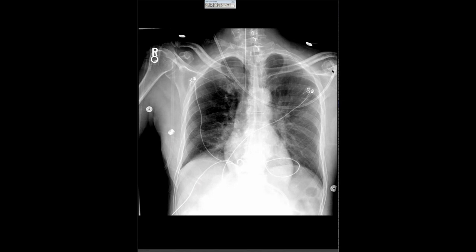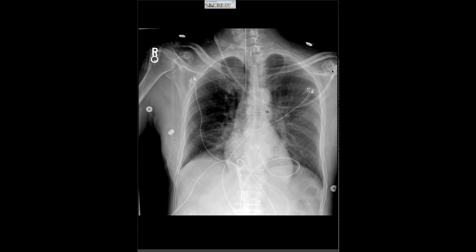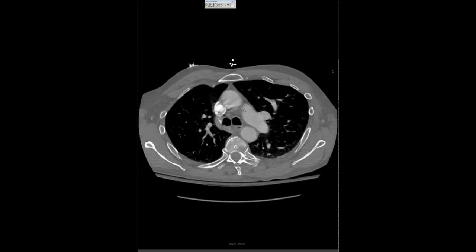All right, so this is a radiograph of someone in the ICU, and you can see there's clear asymmetry between the left lung, which is more radiodense than the right lung. Very ground glassy. So differential considerations for this would be layering pleural effusion, asymmetric soft tissue. We noticed that they're intubated in the ICU, so probably not able to follow breath hold instructions for the radiograph. So I presume this is an end expiration. And this is a good example of what I think is probably a Westermark sign.